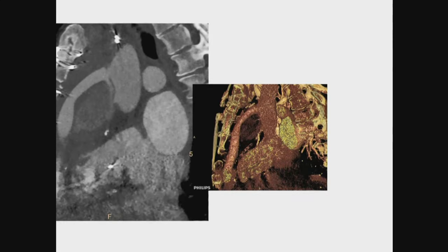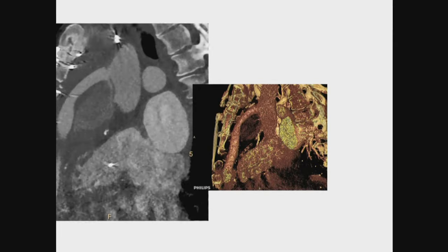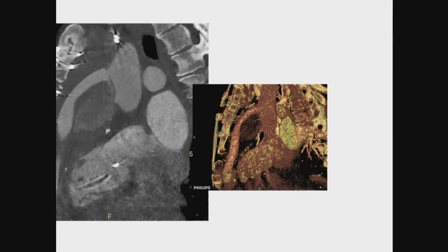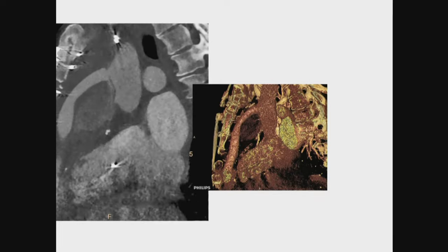And I promise the next time I'll show you the CT, where you can see the outflow cannula actually swinging around, essentially detached and floating in the pool of blood.